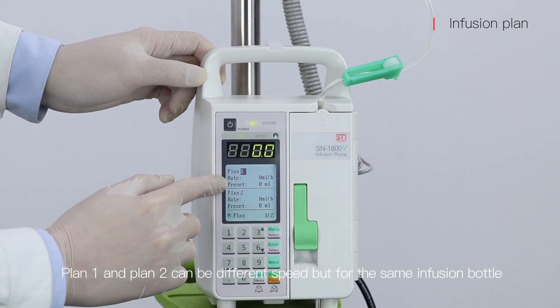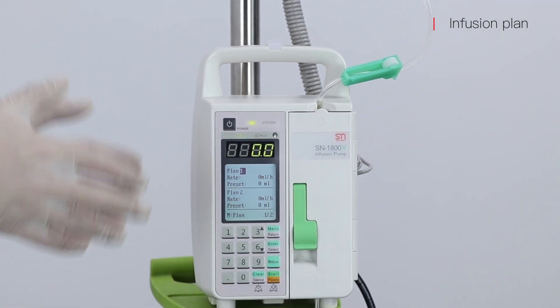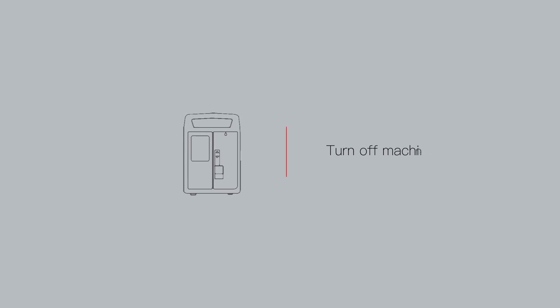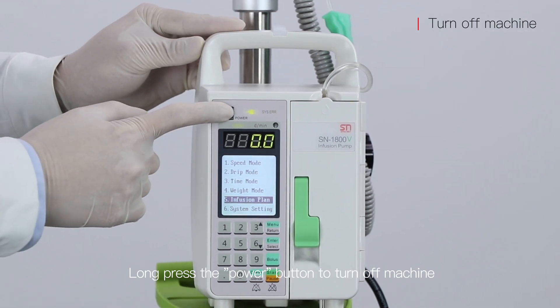Plan 1 and Plan 2 can have different speeds but for the same infusion bottle. Long press the power button to turn off the machine.